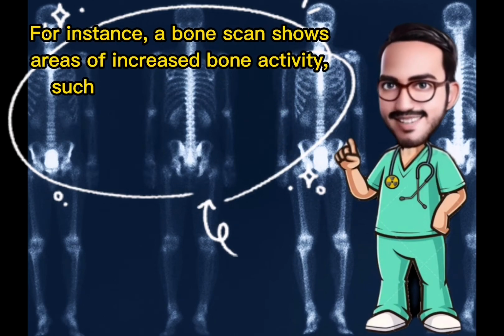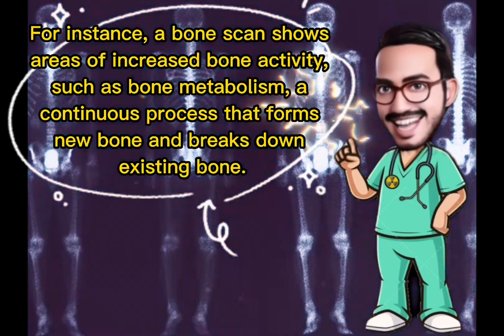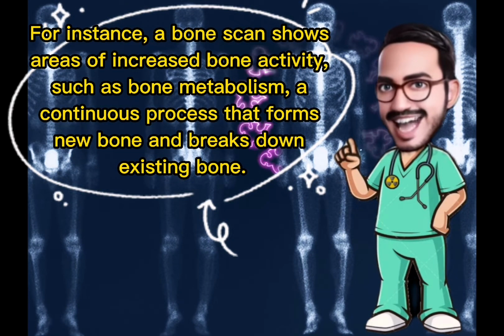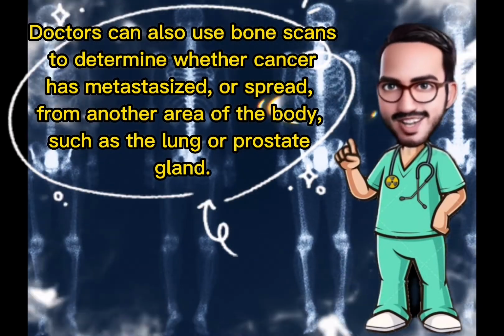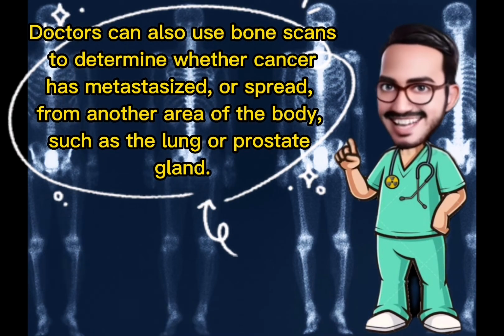For instance, a bone scan shows areas of increased bone activity, such as bone metabolism, a continuous process that forms new bone and breaks down existing bone. Doctors can also use bone scans to determine whether cancer has metastasized or spread from another area of the body, such as the lung or prostate gland.